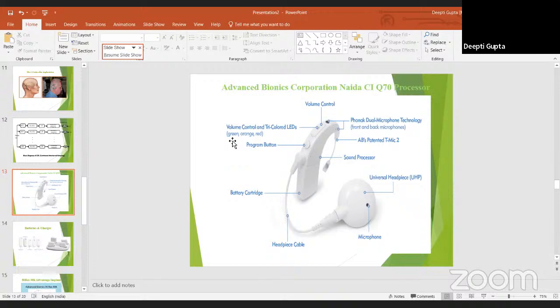What happens is: one green blink indicates program 1. Two green blinks means program 2. Three blinks means program 3. Four blinks means program 4. And 5 blinks means program 5. Like that. If it is flickering, that is one thing, but if the green light is solid, it means a processor that is not yet programmed. It means there is no program in the processor. We need to program it.